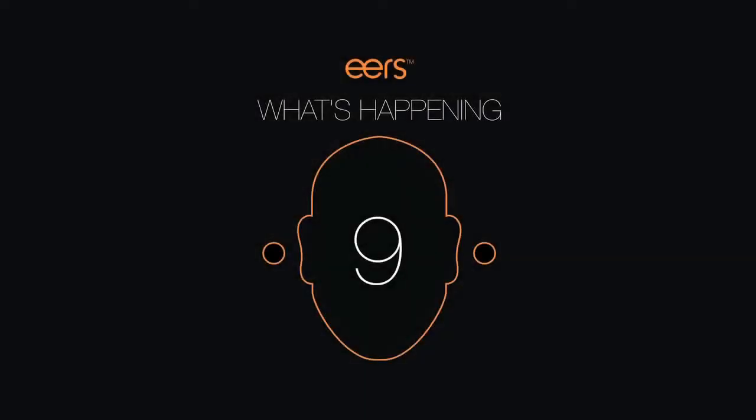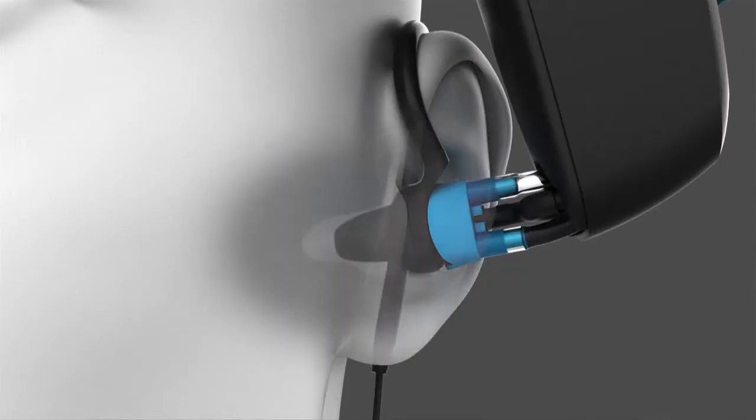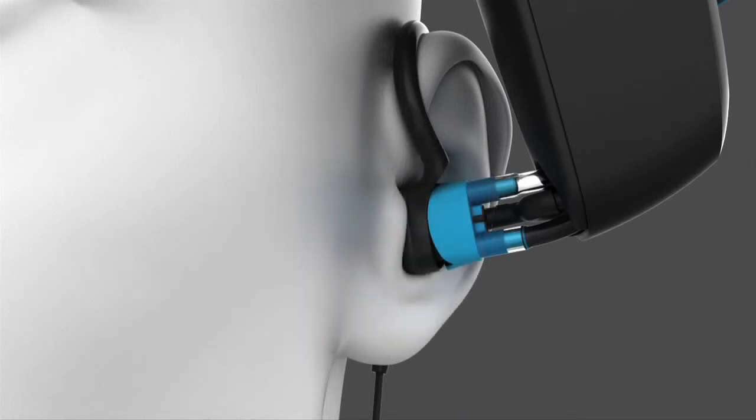Remember, no talking or moving your jaw. What's happening now is that the two-part silicone is mixing and flowing inside the earpiece, expanding inside your ear. You will notice everything is starting to get quieter.